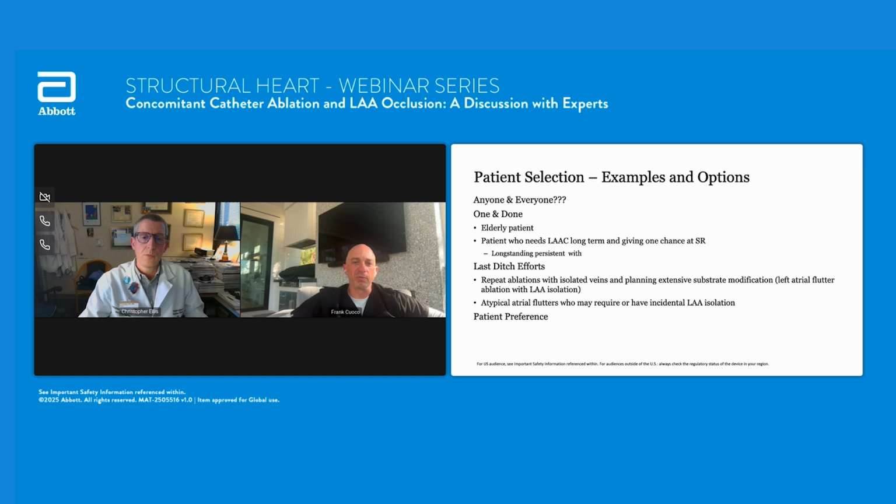I do think about patients that I really want to do one procedure on, what I consider a one and done. For example, an elderly patient with persistent AFib who has a clear indication for a left atrial appendage closure, either a very high bleeding risk or a risk of bleeding, but who also probably has symptoms from their AF. I actually had a patient yesterday that we did a concomitant on, a very robust 92-year-old. A little embarrassed to say she was 92, but she was spry as could be and very active and really felt poorly in AF. She was breaking through with AF despite amiodarone, and she was clearly a fall risk and clearly not a good candidate for long-term anticoagulation.